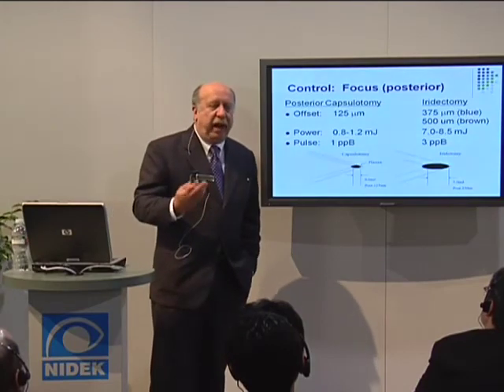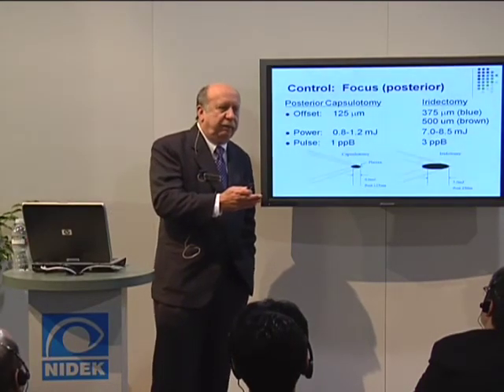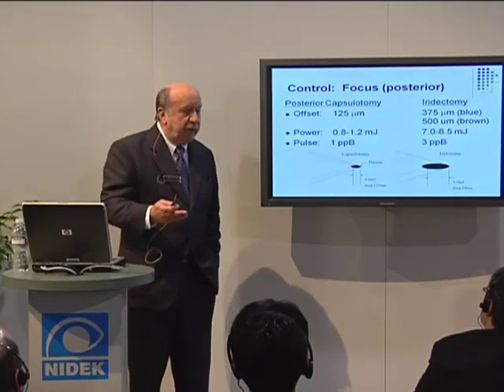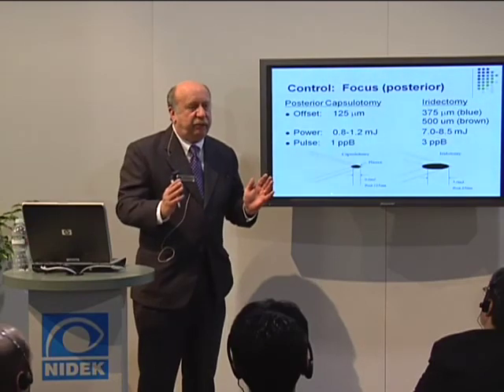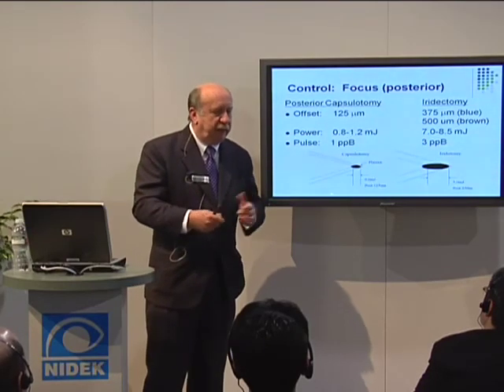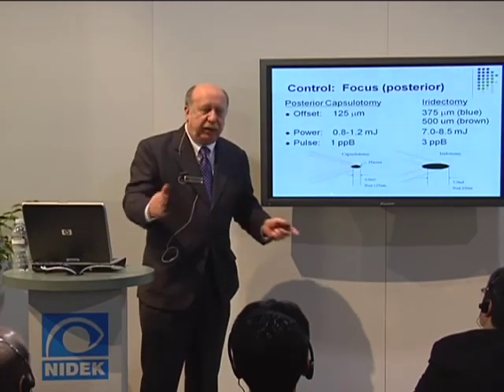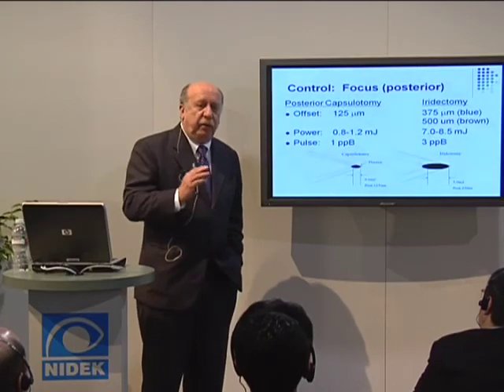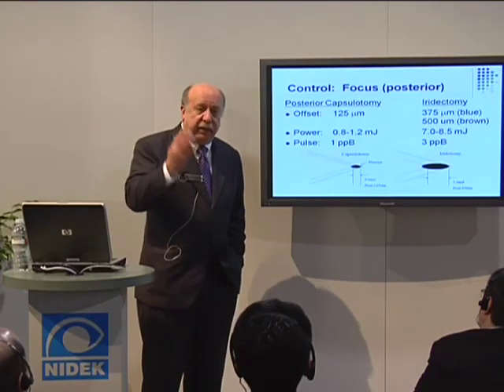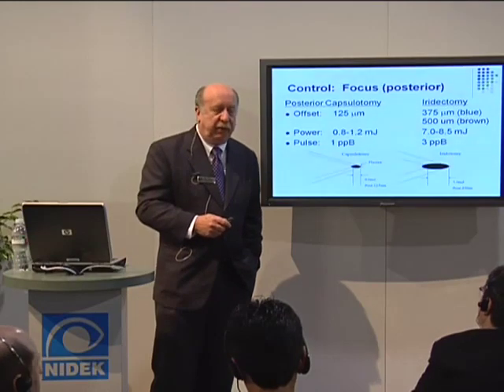And the brown iris leans more toward swelling or edema. So starting off 3 times thicker, it might be 6 times thicker, so it's almost like, in some cases, peeling an onion. You start going and you shoot and you get debris, you shoot again, and so forth. So if there's an edematous iris, some doctors will take many shots and get some pigmentation changes there, but he'll get through.